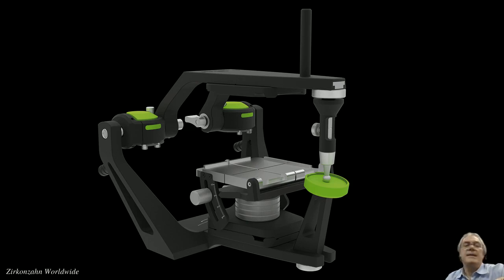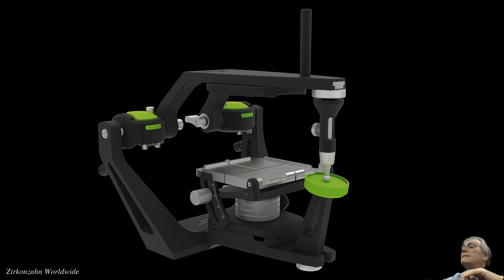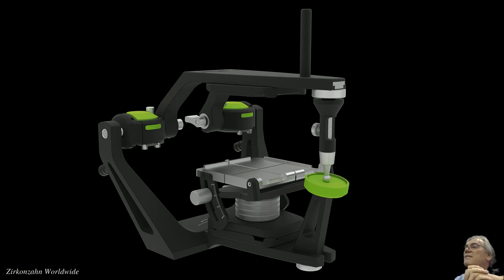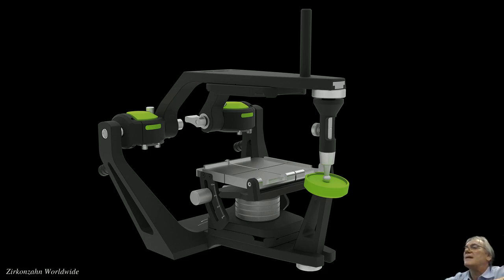The PS1 articulator belongs to the Archon family of articulators, where the condyles are situated at the bottom body of the device. Besides the protrusive and lateral axes of movements, we can also adjust the retrusive movements, therefore classifying the PS1 as a fully adjustable articulator.